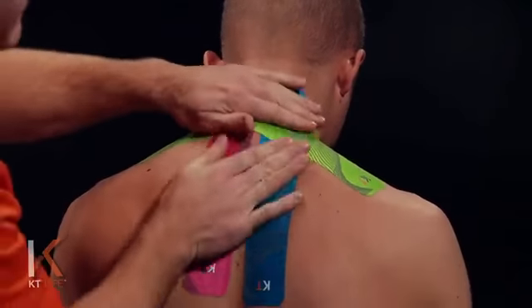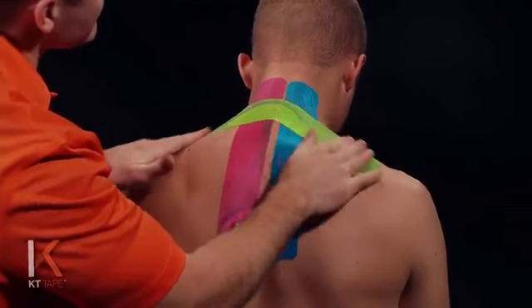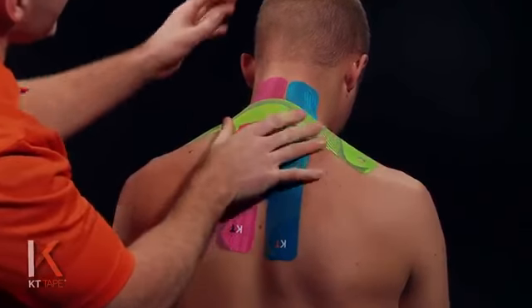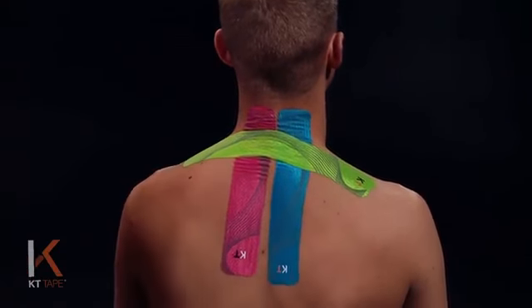I'm going to give the whole application a little bit of friction that creates heat. That allows the adhesive to really stick to the skin well. Okay, that looks good. Now we can come up out of that position. And you should have a little bit of wrinkling in the tape. That looks great. Some helpful tips before applying.